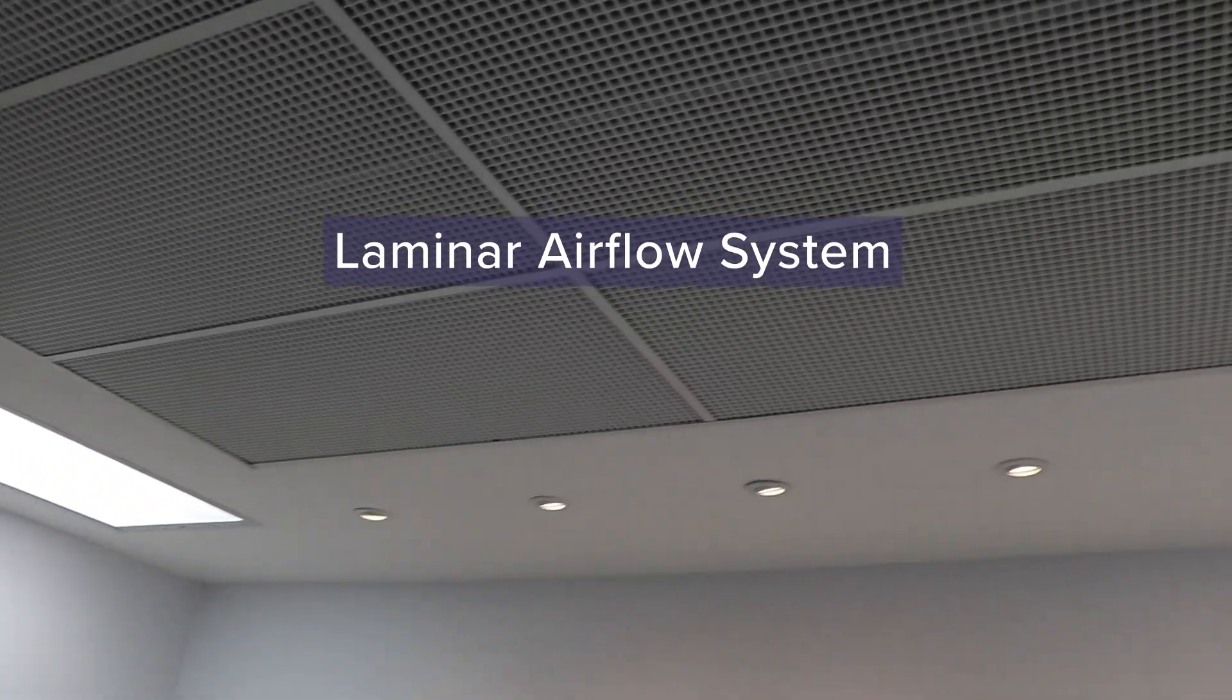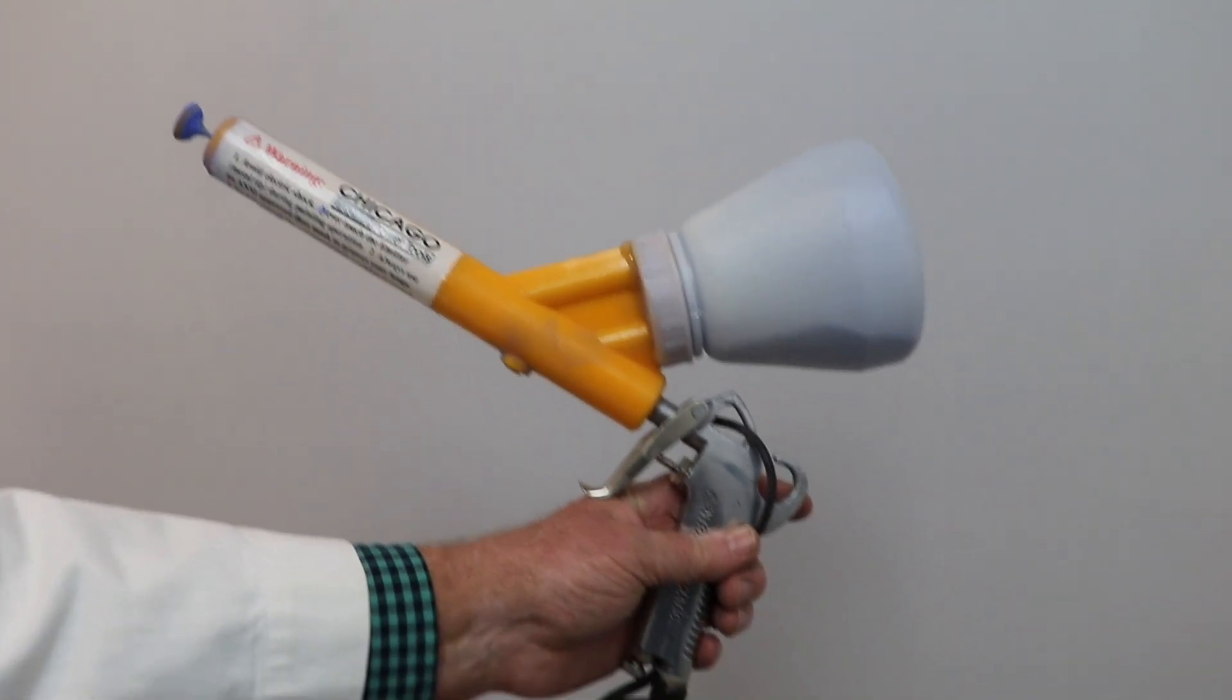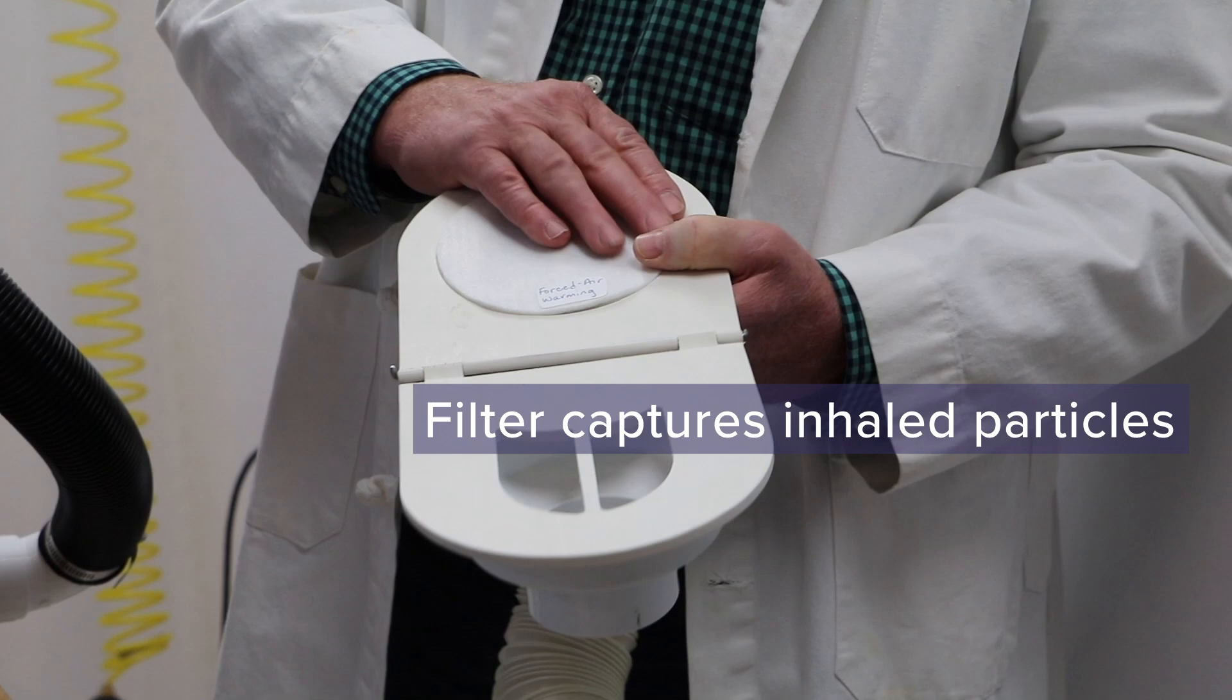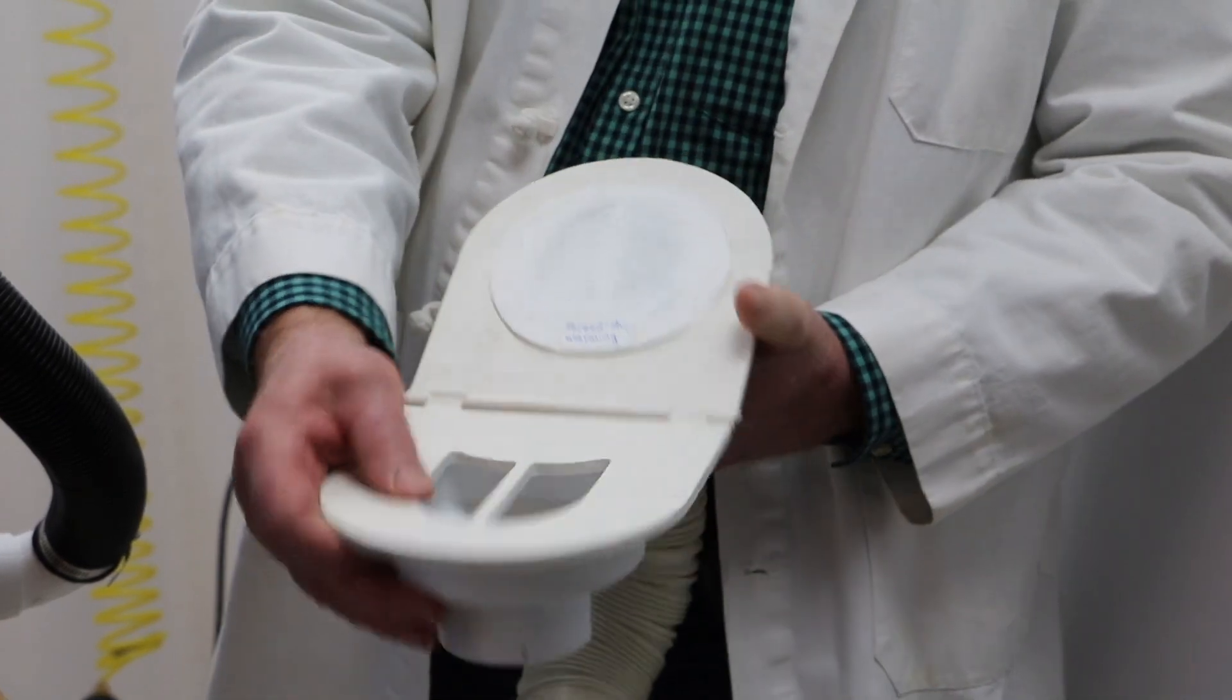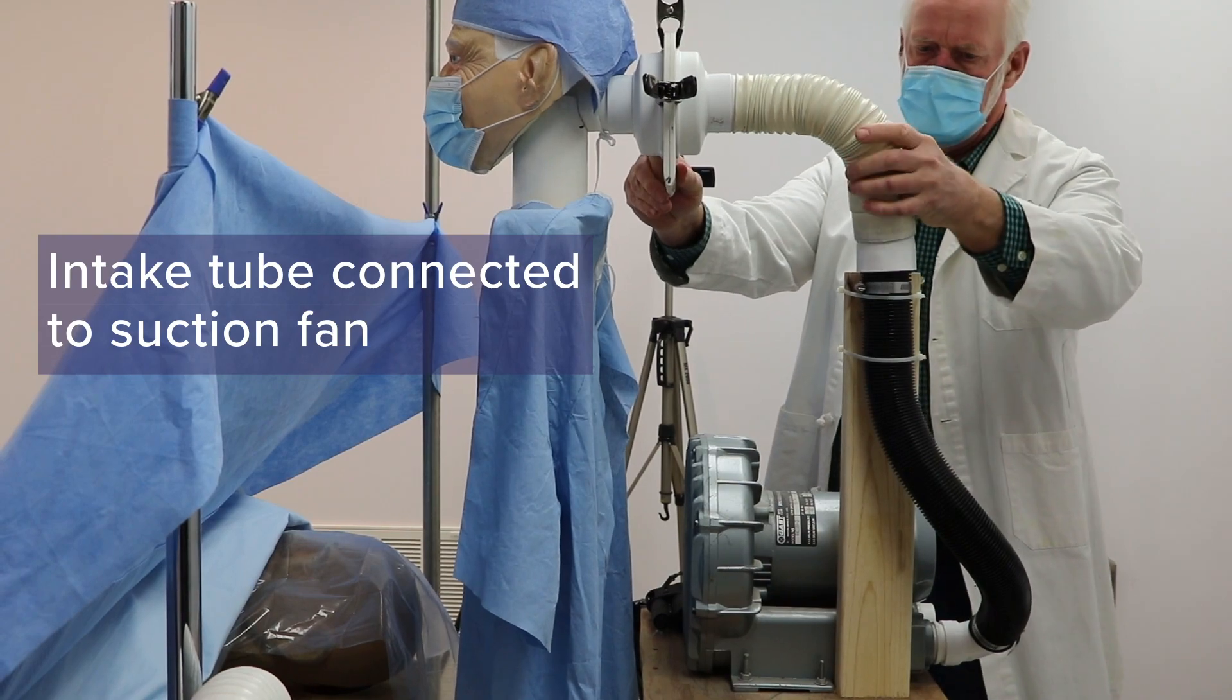The laboratory is equipped with a laminar airflow system. An air pressurized gun dispenses blue chalk powder to simulate airborne contaminants. A clean filter is placed over the air flow path to capture inhaled particles. The intake tube connects the anesthesia provider to the suction fan.